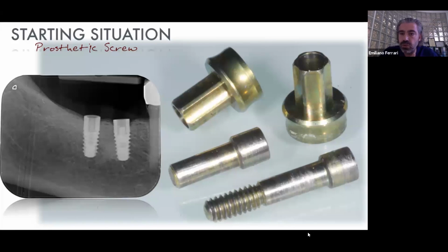But one opportunity that the Rhein83 factory gives to the market is to customize the attachment for an unknown implant. The only thing that you have to do is take something that was screwed on the implant, so in this case an abutment, but it's enough also a cover screw or a healing screw, something that fits perfectly with the implant, in which they can read the screw and the implant part. That way, they can manage to customize the abutment for you for those unknown implants.